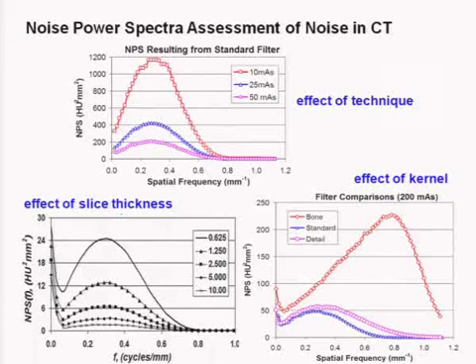And now that some scanners have 30 or 40 different kernels, we medical physicists are often asked to try to optimize that, and you're going to have a hard time doing that based upon a subjective radiologist looking at it. Oh, I like that one better than that one. I mean, you'll be chasing your tail on that type of thing. So I'm a strong believer in this aspect.